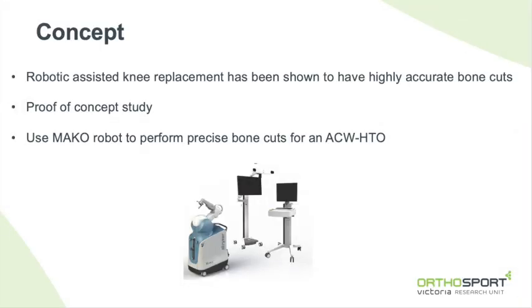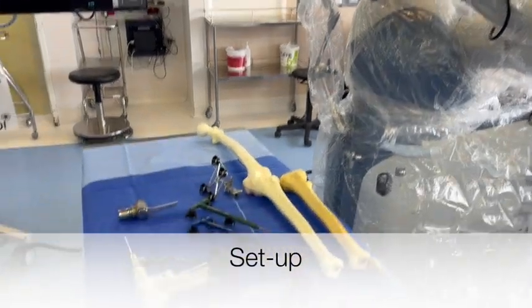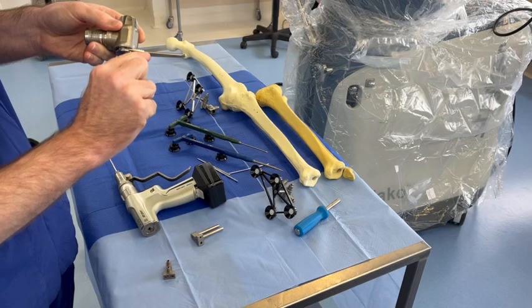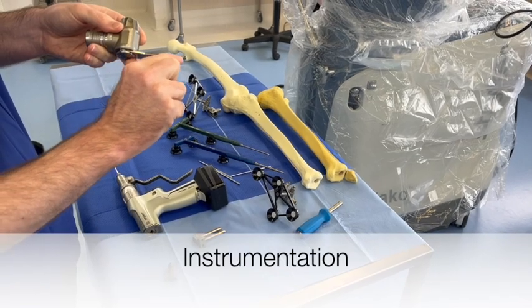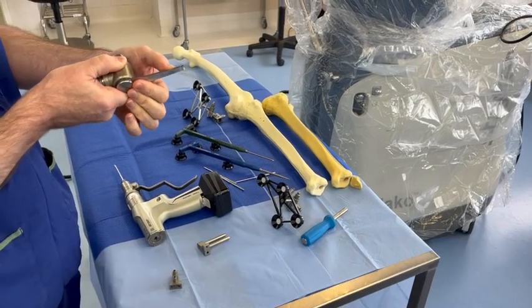Robotically assisted knee replacement provides high levels of accuracy. This proof of concept uses the established precision of a robotic cutting system for a new application to perform an anterior closing wedge osteotomy. The system comprises a robotic arm, an optical array, and a computer. A saw of 2 mm thickness attaches to the robotic arm, which has a limited excursion. Its stiffness allows for greater accuracy.